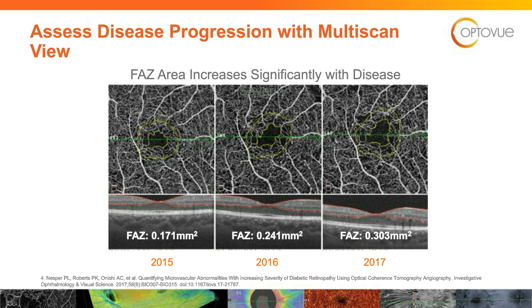I would consider maybe an ERG at that point. We do a lot of ERGs already because this pairs to me very well with structure function, OCTA, ERG. So those are things that I would consider. So would I refer out? No, I would follow that patient more closely, potentially further testing, potentially a supplement, more stringent education that you are at risk because of the early signs we are seeing on progressing through that diabetic retinopathy.